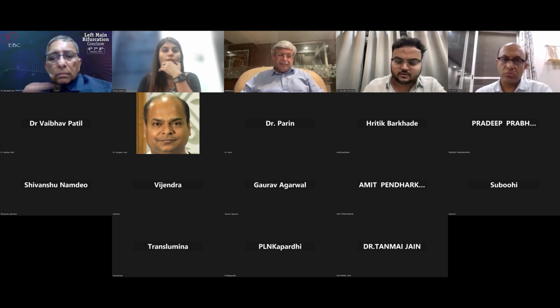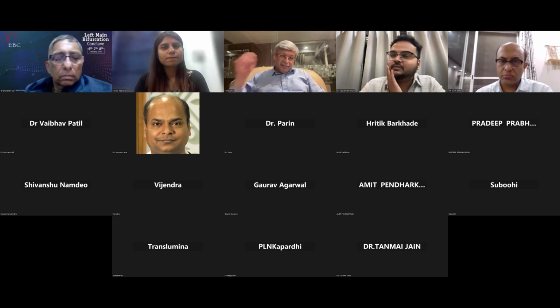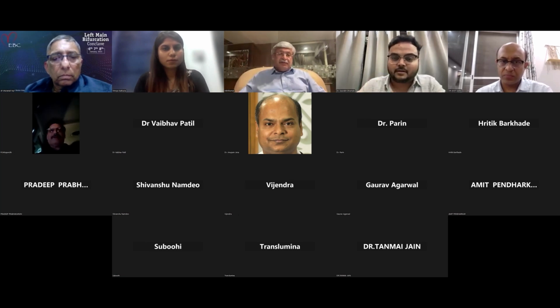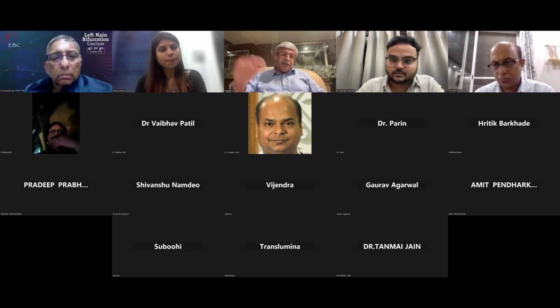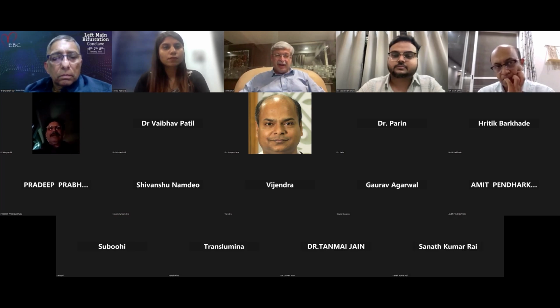So I think the calcium burden was not too high, as you could see in the OCT. So we thought we'd take our chances with the NC balloon first. I completely agree. When you dilate with a balloon of this size, you can end up with a dissection downstream, especially from the shoulder of the calcific area, the junction between the shoulder and the non-calcific segment. Sometimes you have severe dissections downstream when you dilate with a balloon of that size.